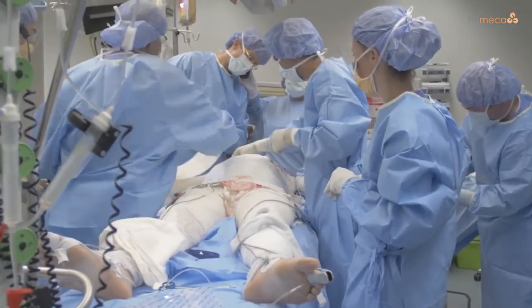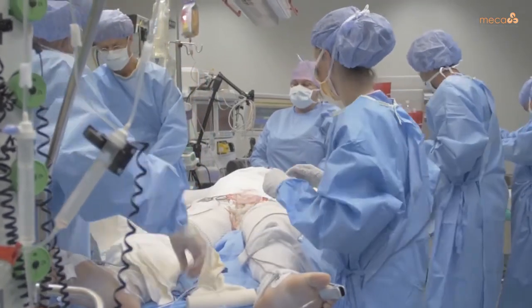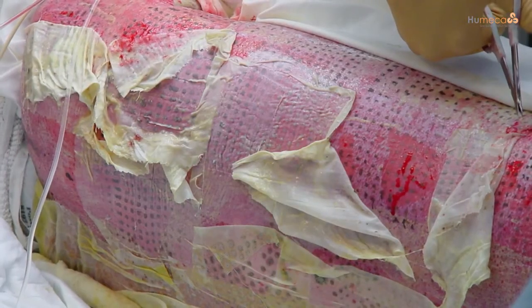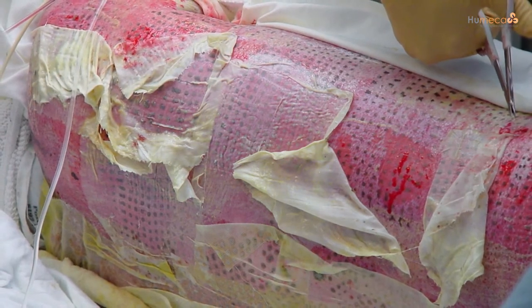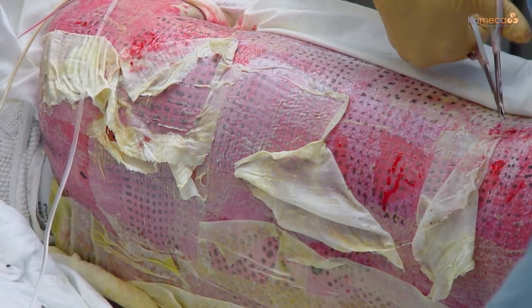The Meek gauzes should remain in situ for six to 14 days. To facilitate removal, 1% silver sulfadiazine (SSD) cream may be put on the gauzes one day prior to removal. Remove the staples and gently peel off the gauze fabric, leaving the graft islands in situ on the wound bed. It is no problem if removal is delayed after day six, as epithelialization continues.